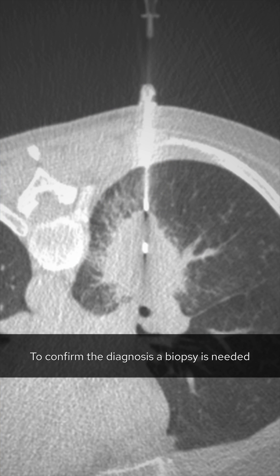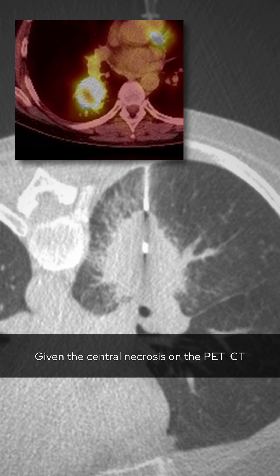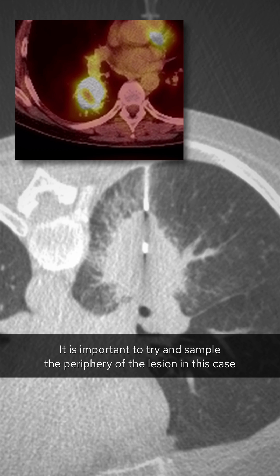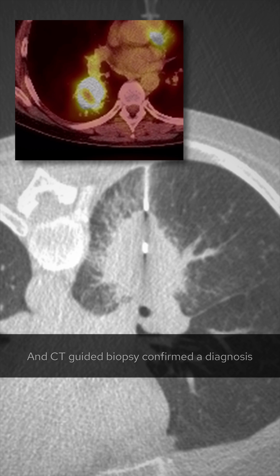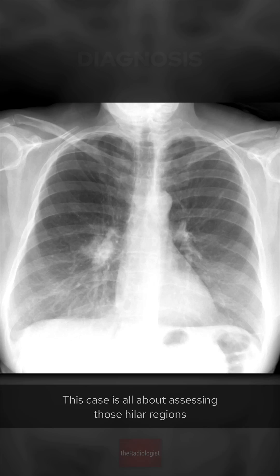To confirm the diagnosis, a biopsy is needed. Given the central necrosis on the PET CT, it's important to try and sample the periphery of the lesion in this case. CT-guided biopsy confirmed the diagnosis of right-sided lung adenocarcinoma.